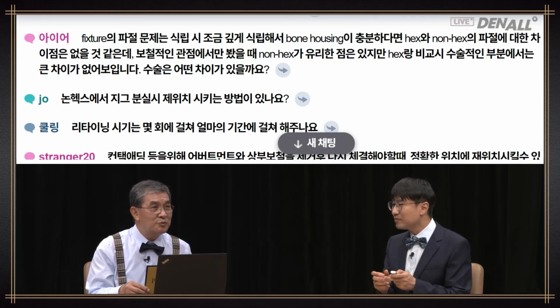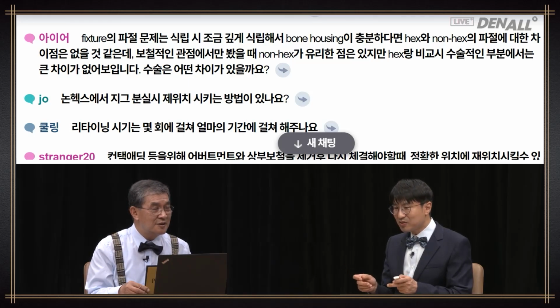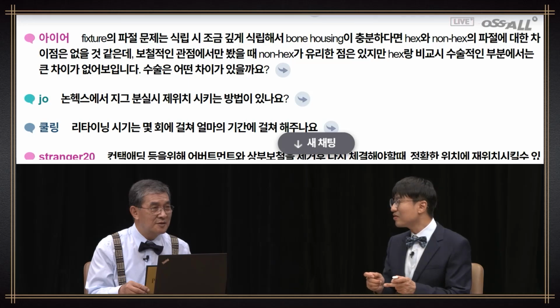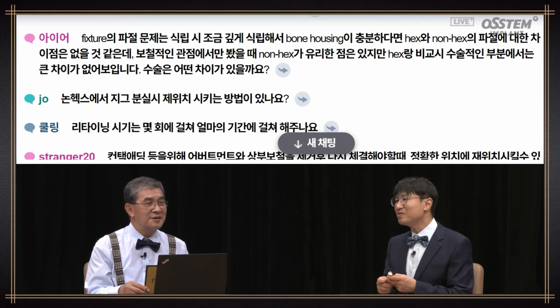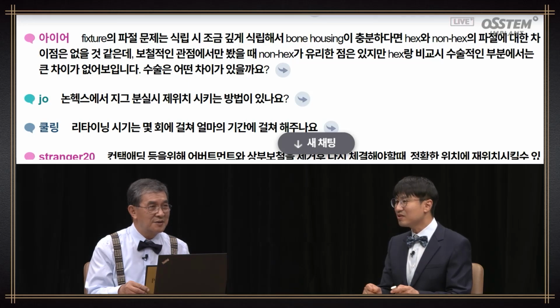Why is surgery difficult? Because there's no hex. You're limited in providing torque in the placement direction, and once it is placed, because there's no hex, removing the implant requires the friction of the mount, so it's very inconvenient. But the advantage outweighs the downside. 3.6 and 4.0 diameters. I hope this becomes more widely used.